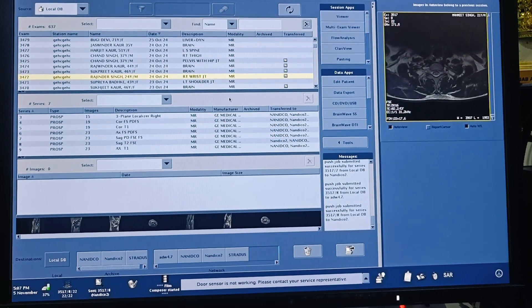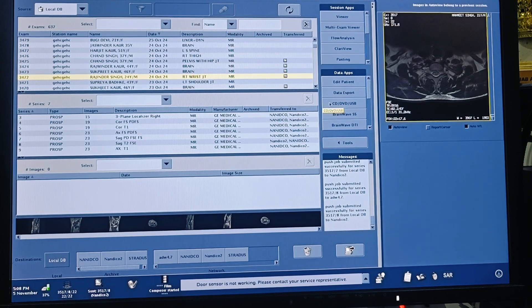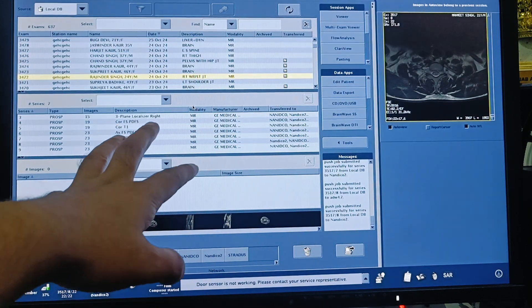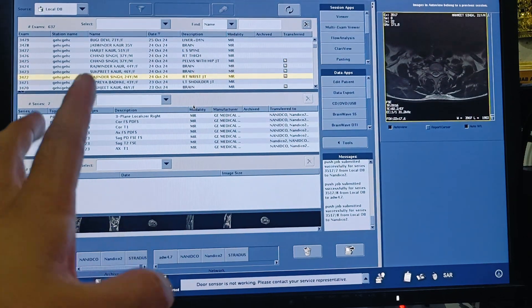Today I want to share with you an MRI wrist joint study. I want to tell about patient position for MRI wrist study and protocols which have to be acquired during wrist joint. Firstly, the patient position is head-first prone with arm up — like Superman position — with the wrist placed in the wrist coil.